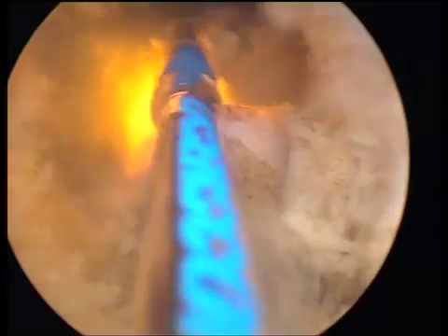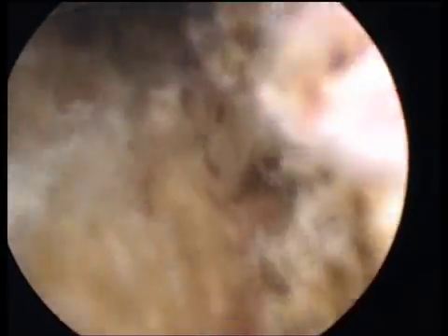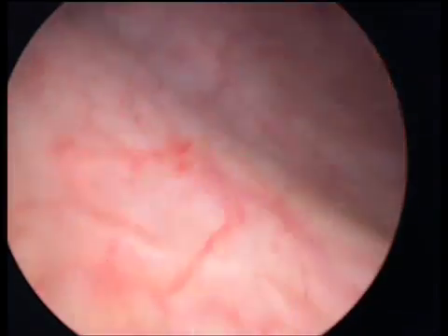This enhanced irrigation — having a suprapubic trocar to drain the saline that is instilled in the bladder during the procedure — is a great help for the treatment of these big prostates.